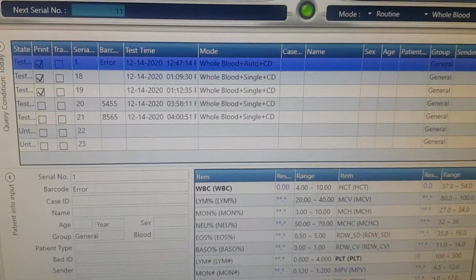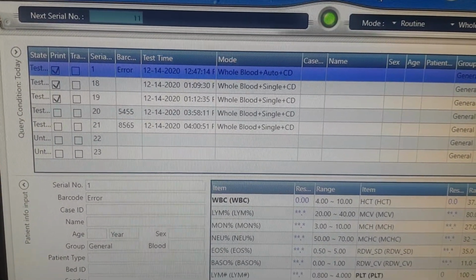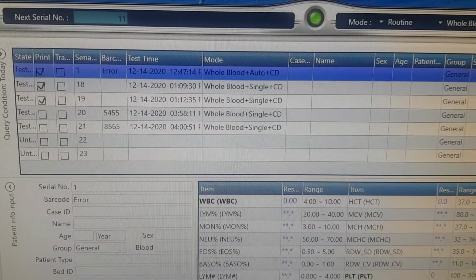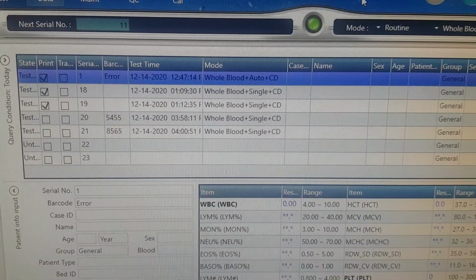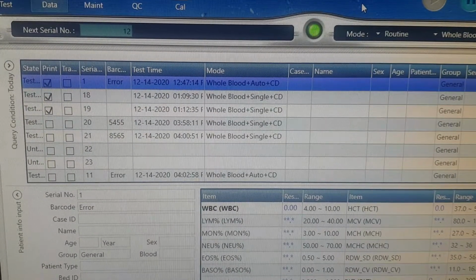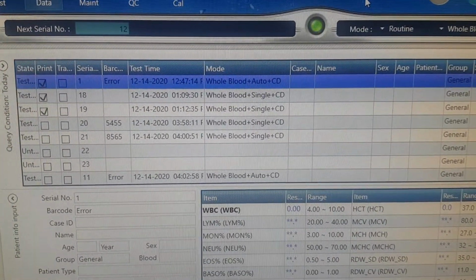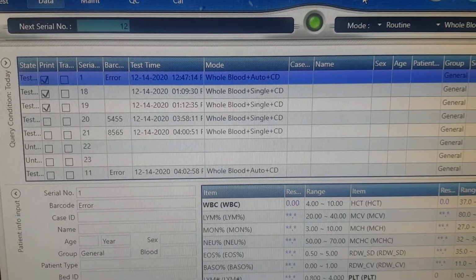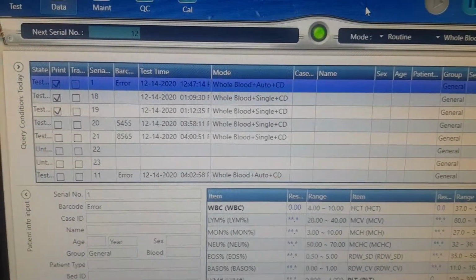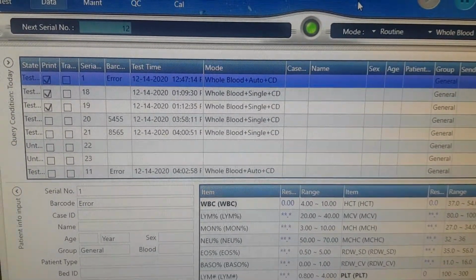We are waiting for the rack results, and we will see. Now I think the result will be displayed. Okay, see, the result number comes to the serial number 11, and it shows error. Error means there is no barcode in the tube, and the serial number is coming from number 11. That means this one is the second rack. First rack was from 0 to 10, and the second rack is from 11 to 20.